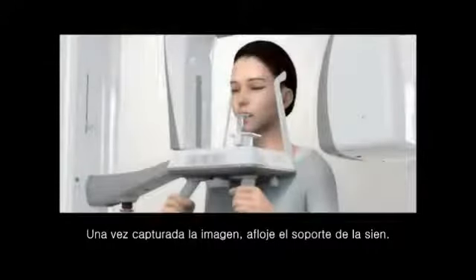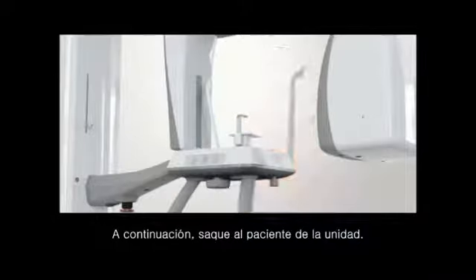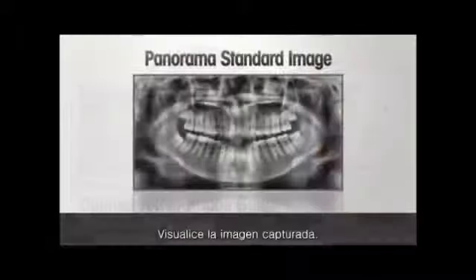After the image capturing, unfasten the temple support. Then guide the patient out of the unit. Check the captured image.